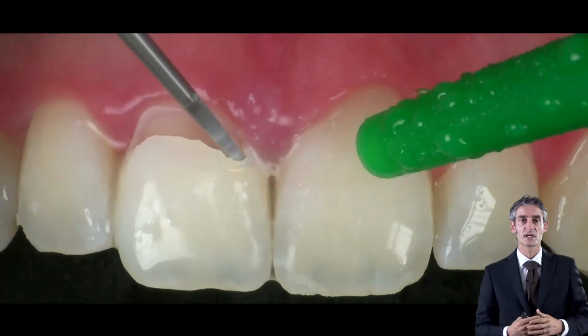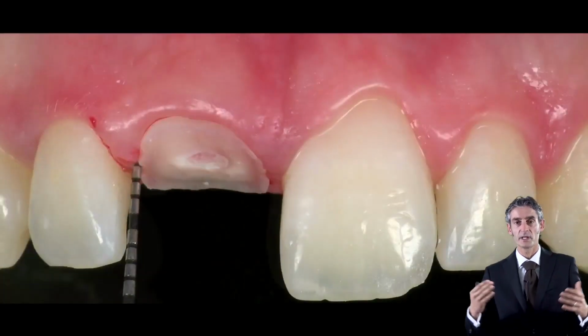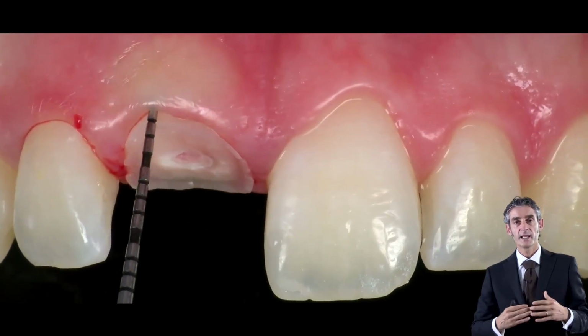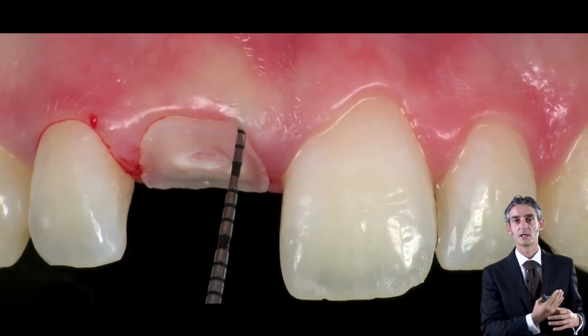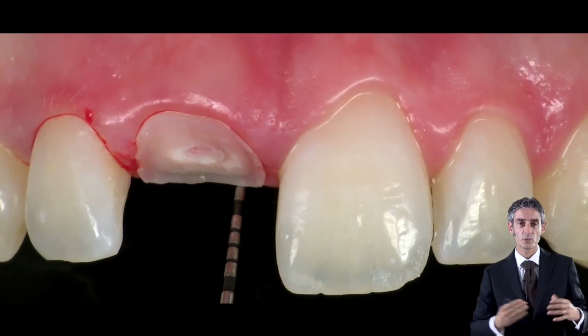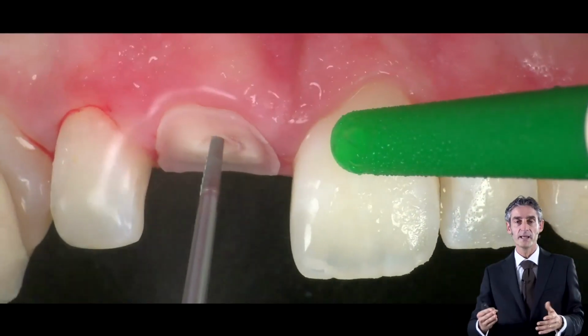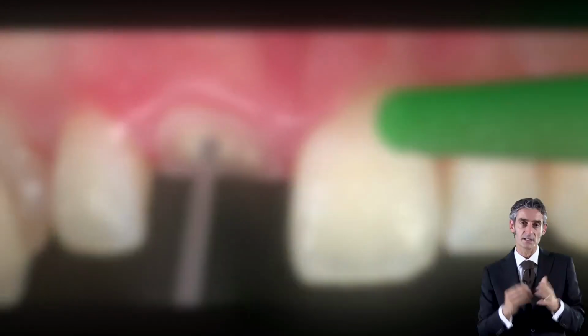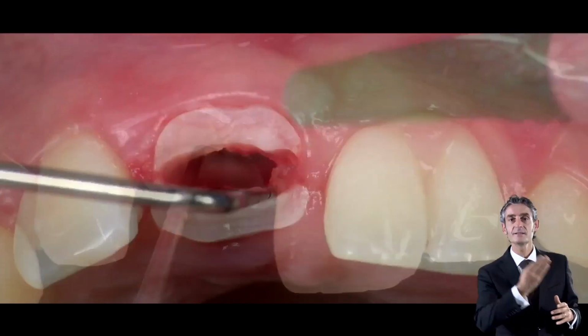Normally I use this type of bar, the bar that we use for the wisdom tooth and so on. After we cut the root in a horizontal way, we can see much better what is going on. Then it's important to leave in a predictable way the shield that we want to have, cutting till the apex.